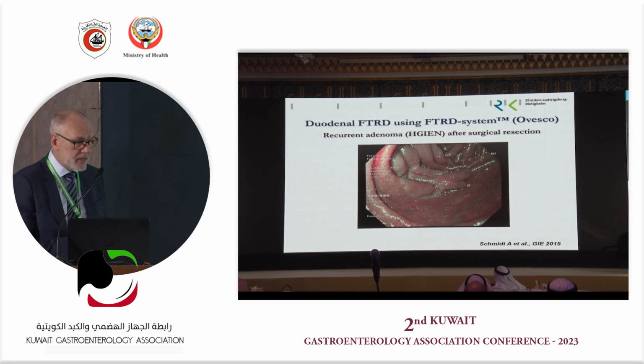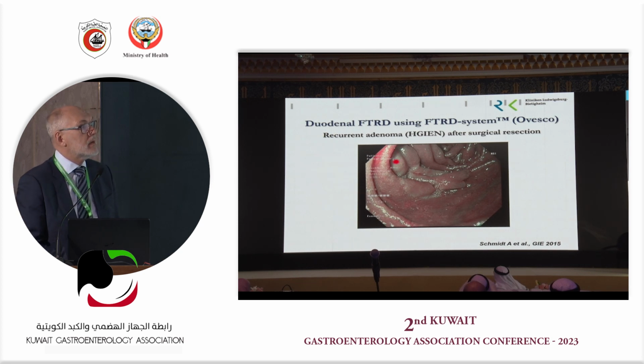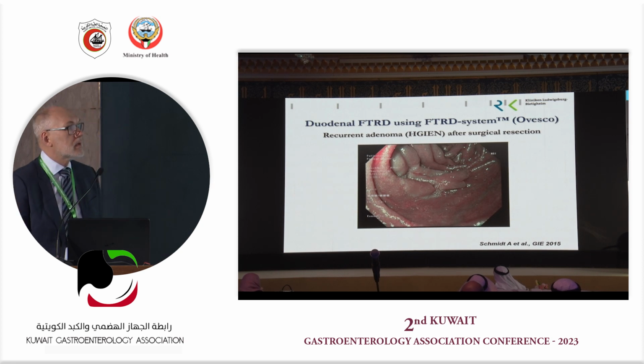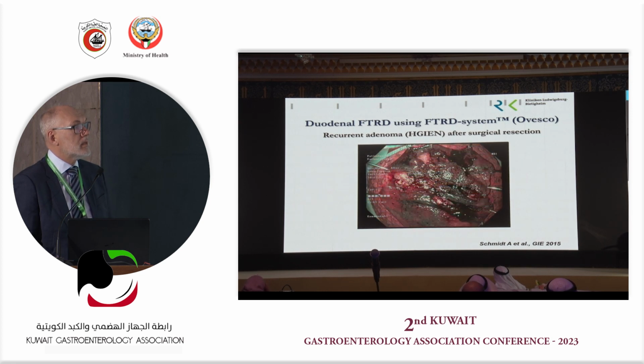The other indications are these epithelial lesions in the duodenum. This is a recurrent adenoma after surgical resection in a 45-year-old patient in the duodenum. So the next stop for this lady would have been a Whipple procedure. And this is something different than just a colonic segmental resection. We did this like we're doing it in the colon, and this was the result.